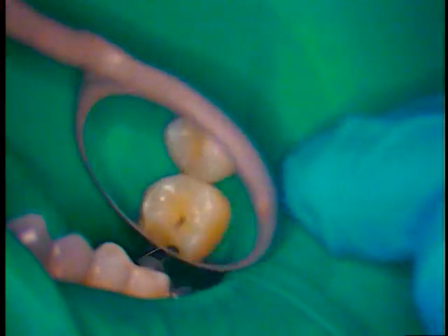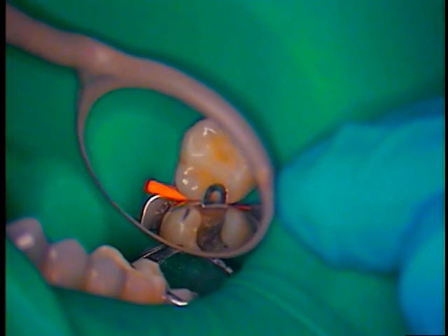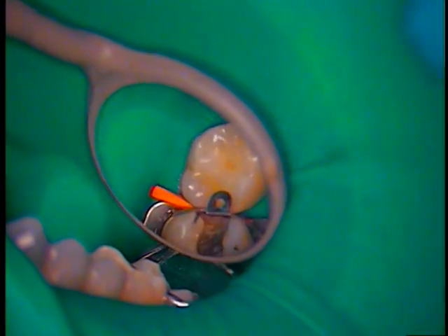I'm gonna hold and push at the same time. Okay, got my wedge in there, clamps next.